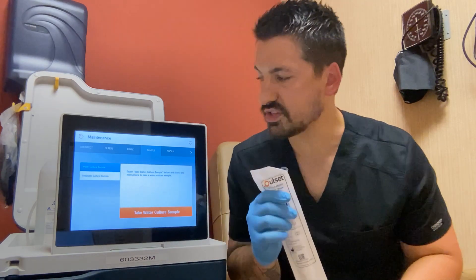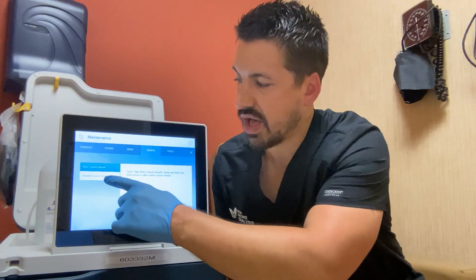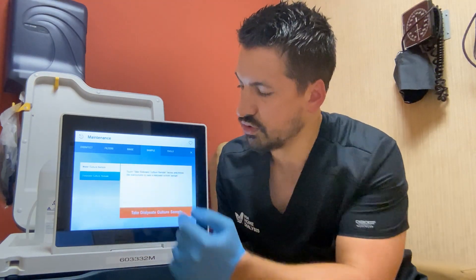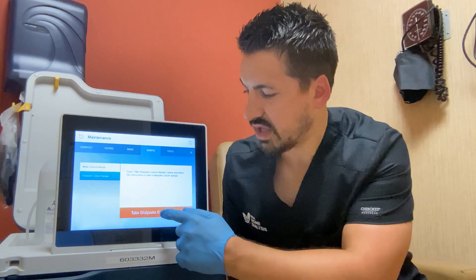I'm already on the dialysate culture screen. I'll highlight dialysate culture — it should be highlighted in blue — and then select the option at the bottom: "Take dialysate culture sampling."